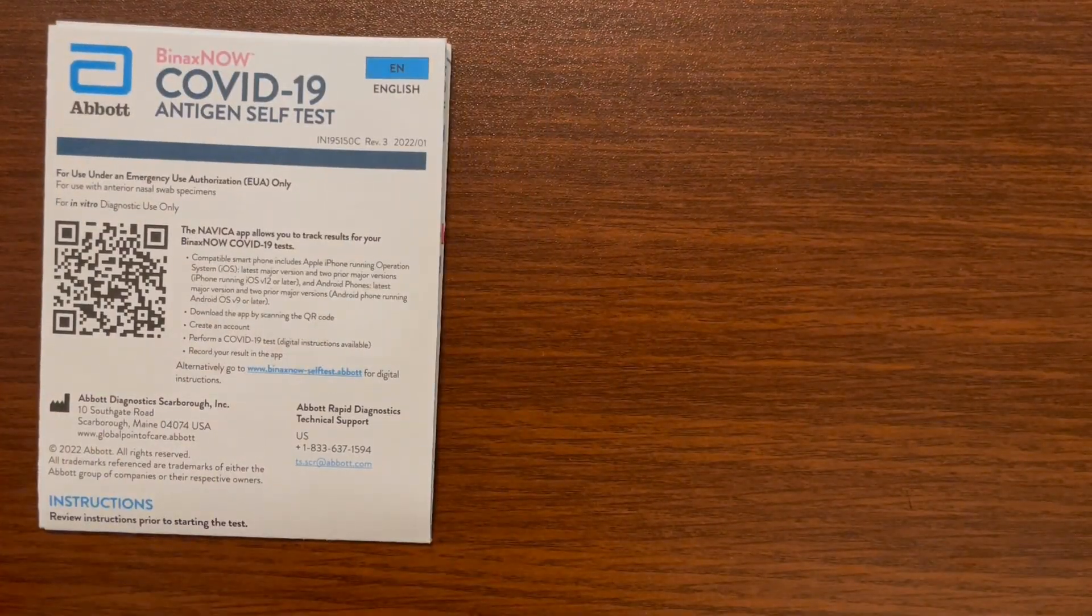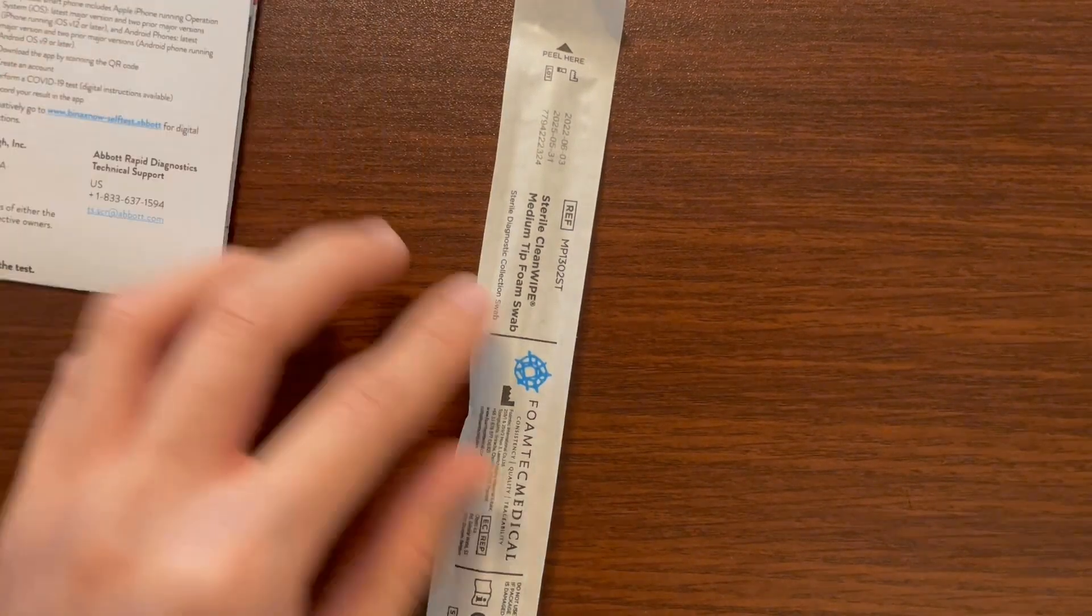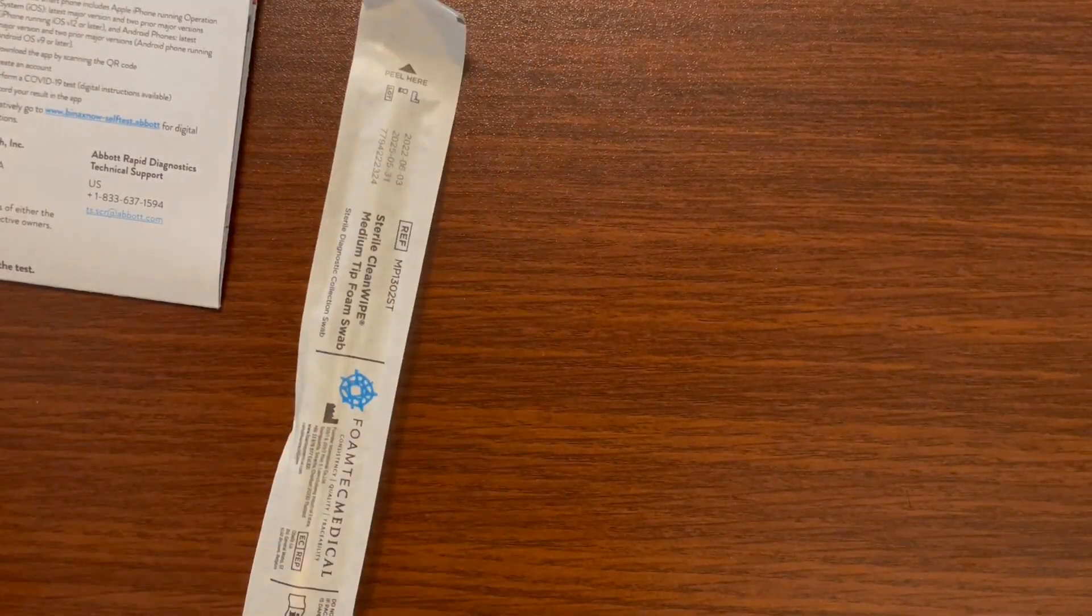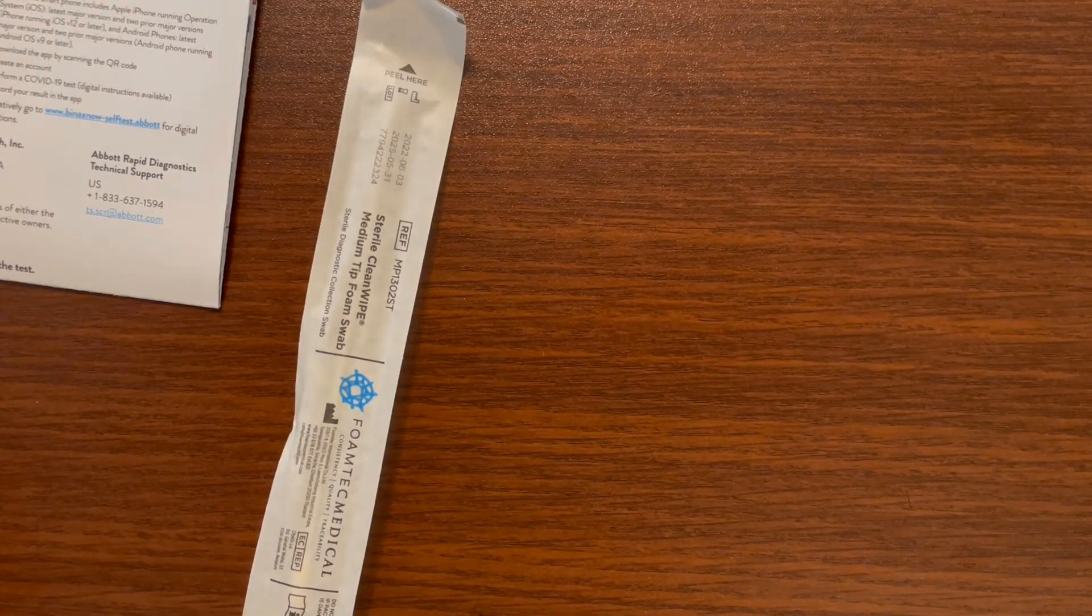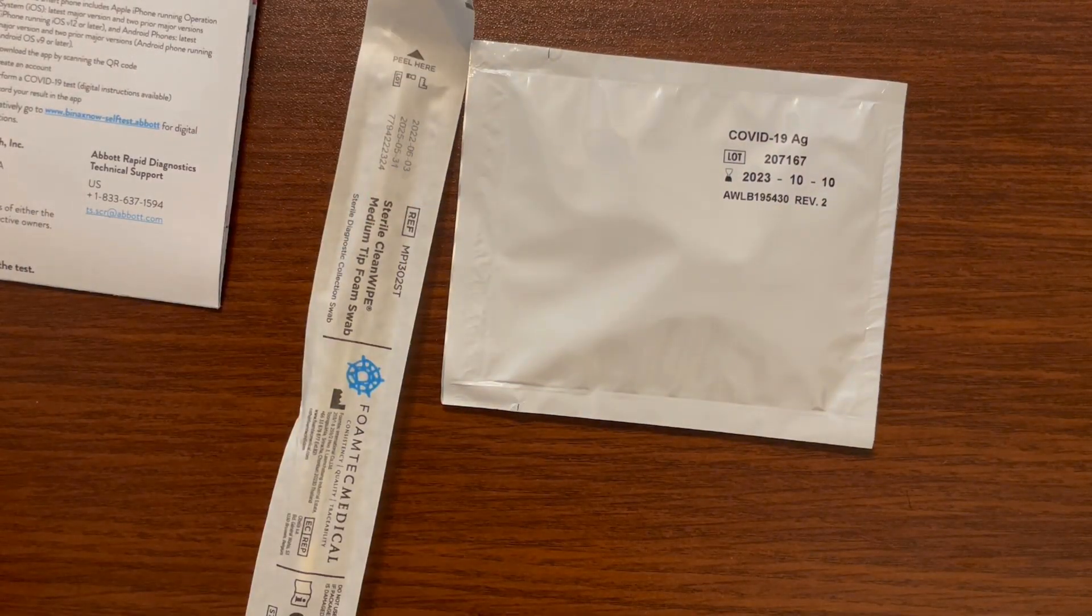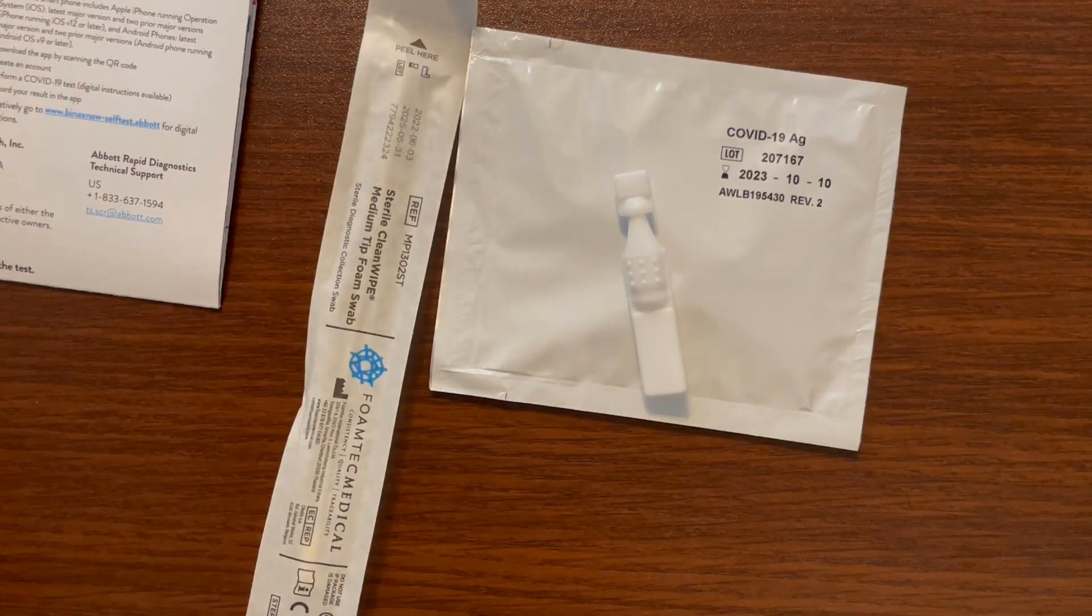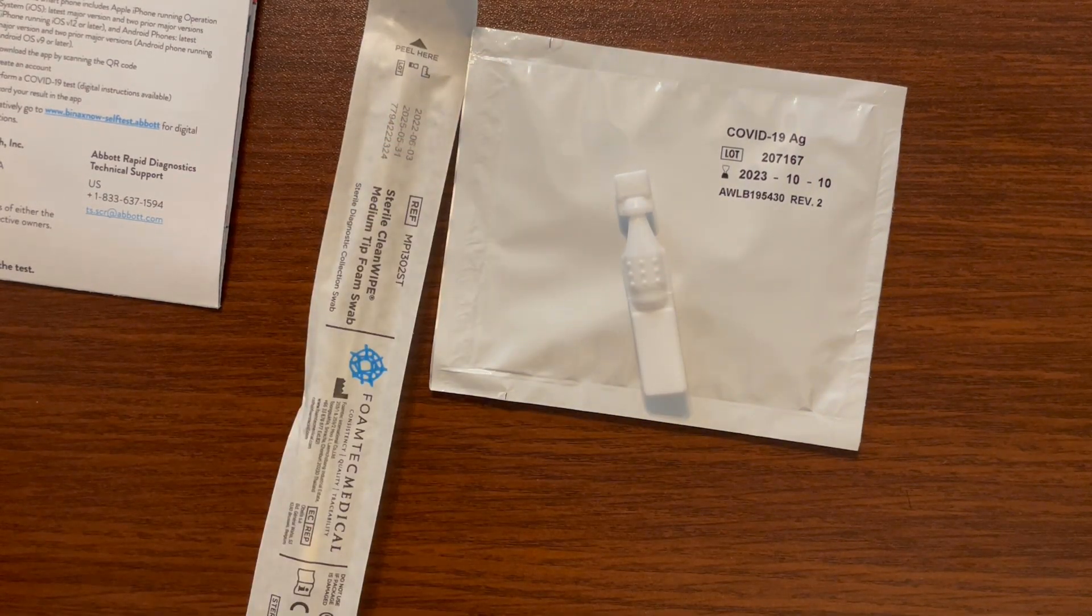You should find a few things inside the box including the instructions, and what you'll need for the actual test is going to be one of these swabs. You will also need to take out a test pouch and then one of these dropper bottles, and that should be it.